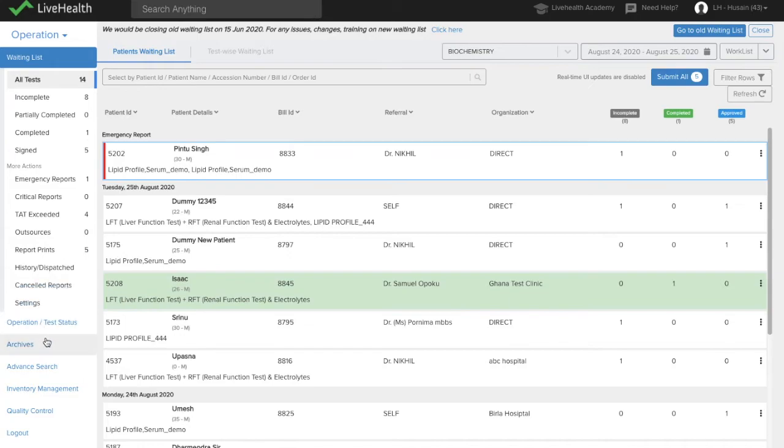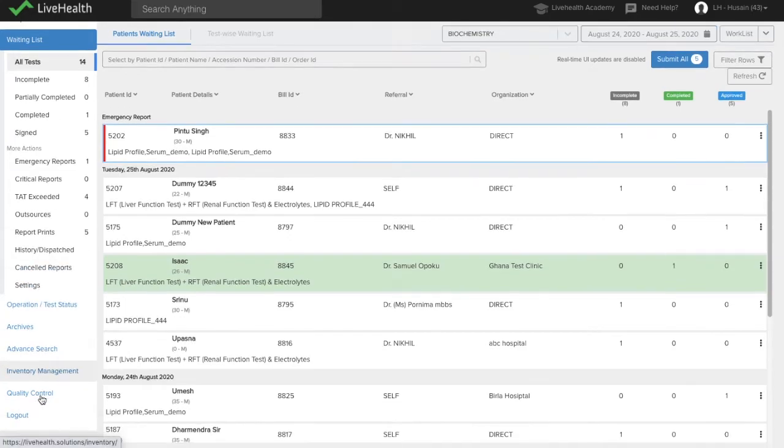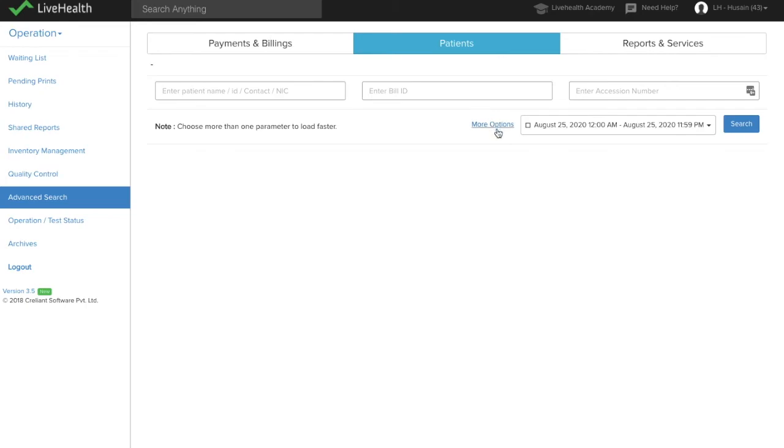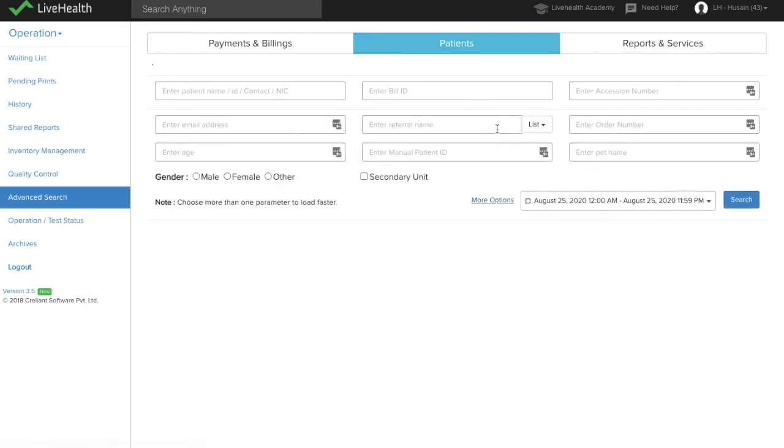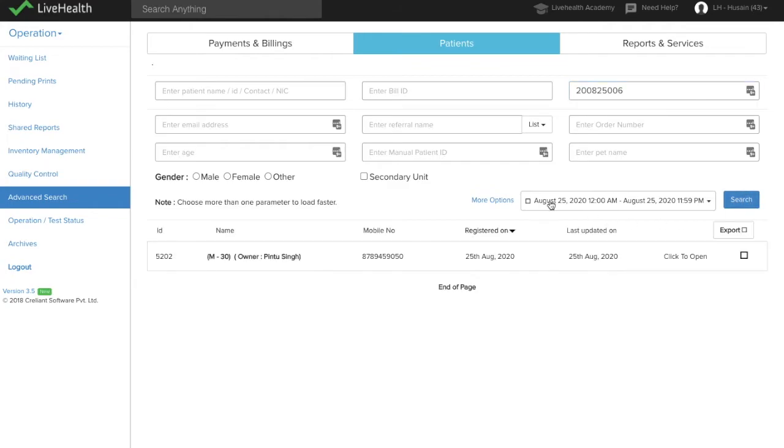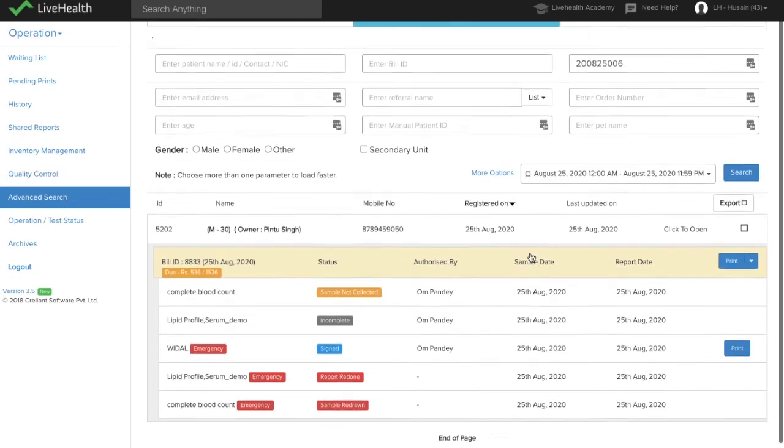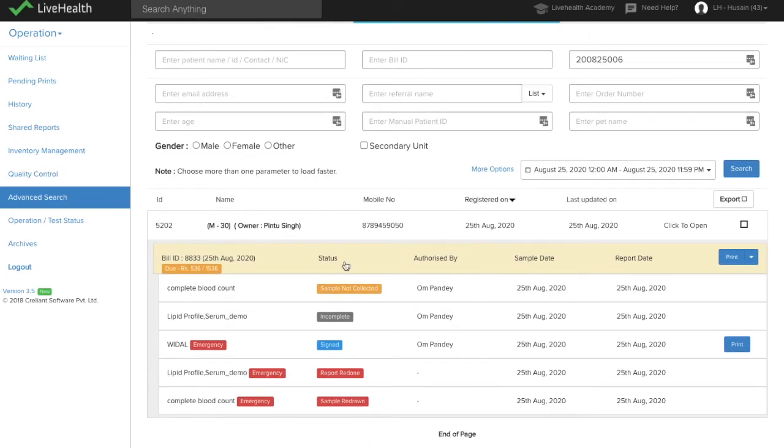We also have advanced search. This search allows you to search patients or reports or even bills using multiple parameters. So suppose if you want to search your patients by using their accession number, you can just enter the accession number and search and you'll see the reports of that patient directly over here and see the status.